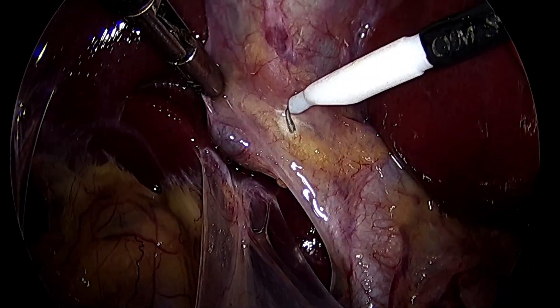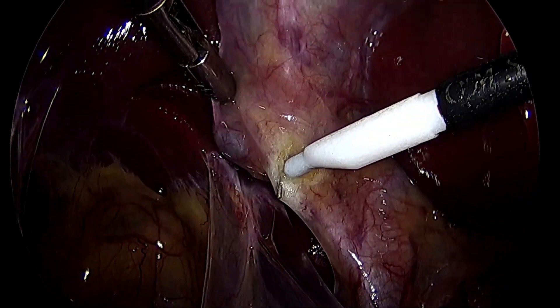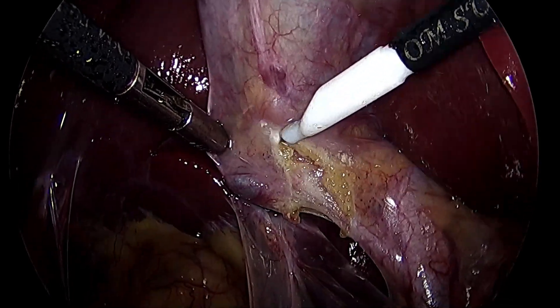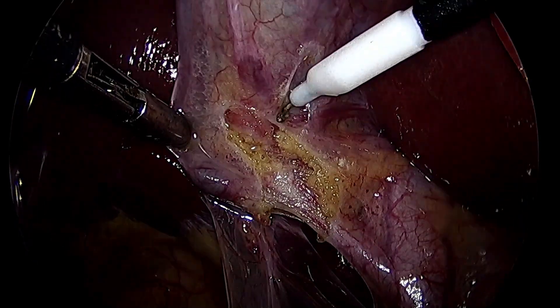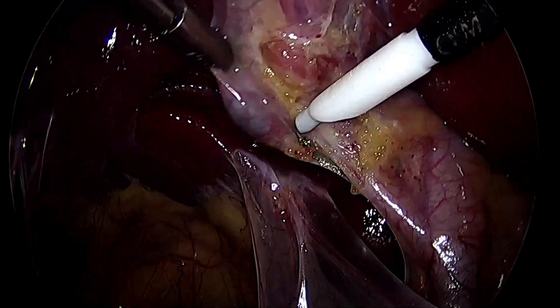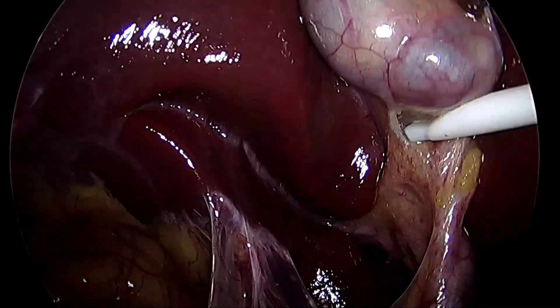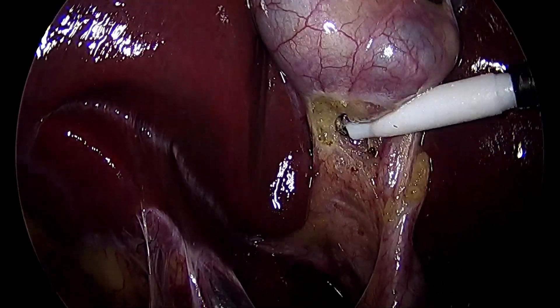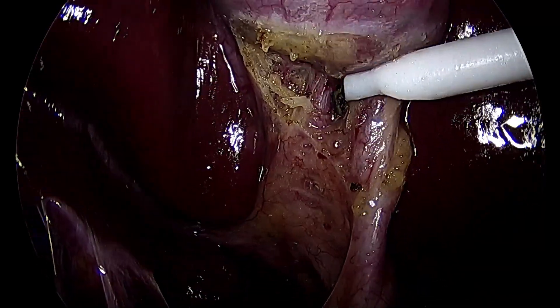You can see it's a fairly thin cystic vessel. There is not too much adhesion, there is very less fat, but you can see that the patient was suffering from acute cholecystitis and because of the interstitial edema there is some tissue reaction. Just clearing the fat and the peritoneal attachment, creating the posterior dissection to create the common window. That's the cystic artery that came into view now.